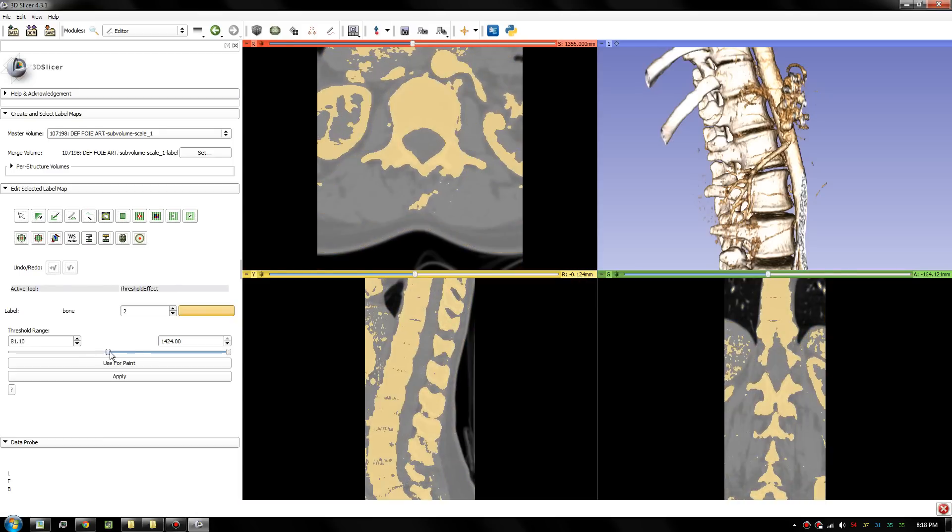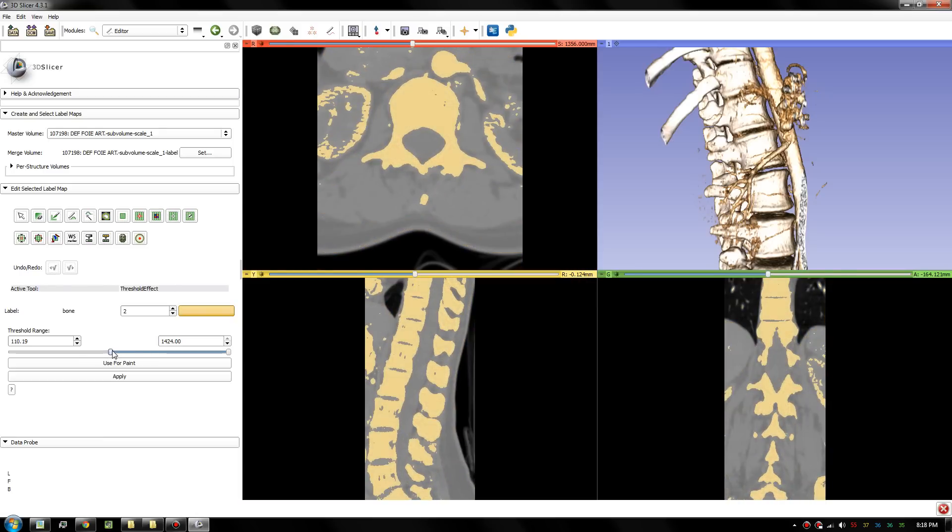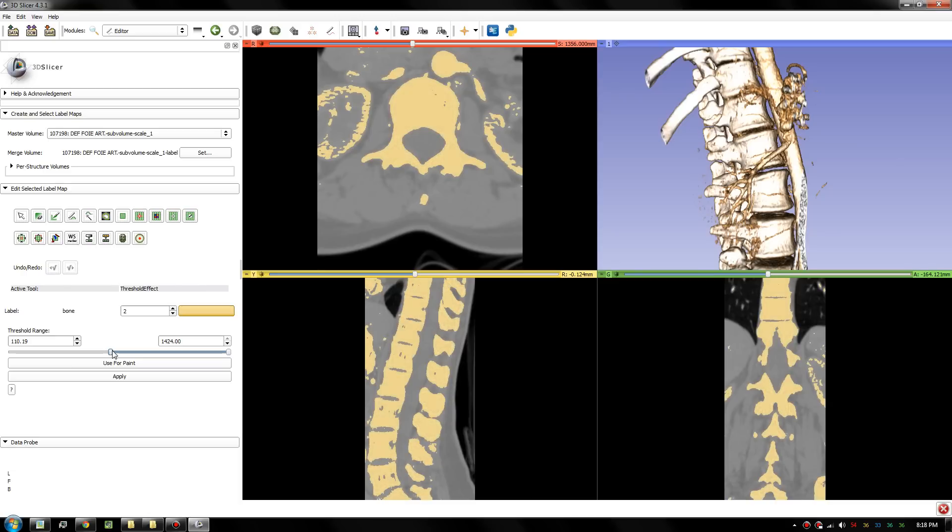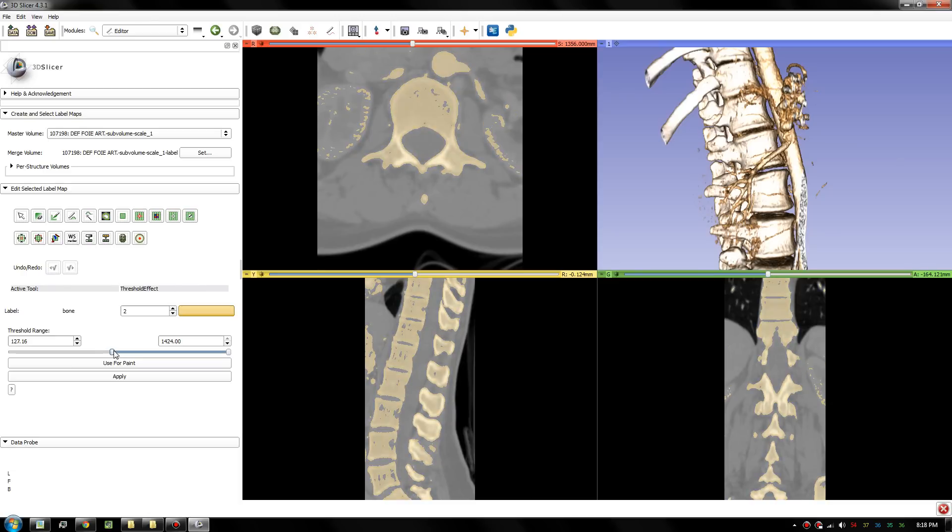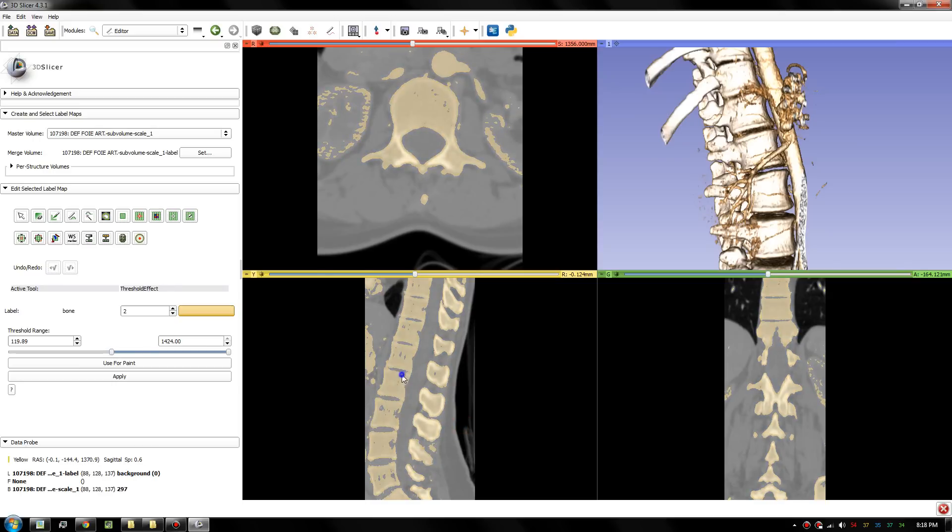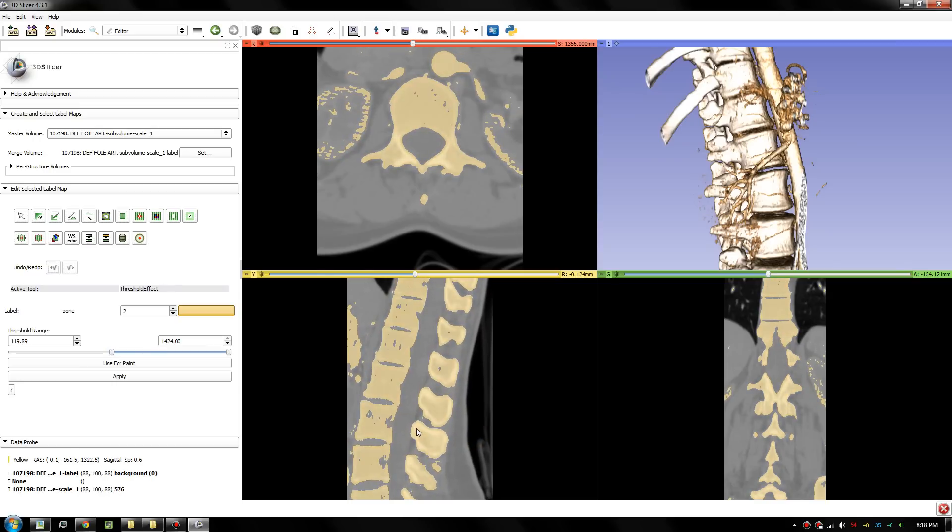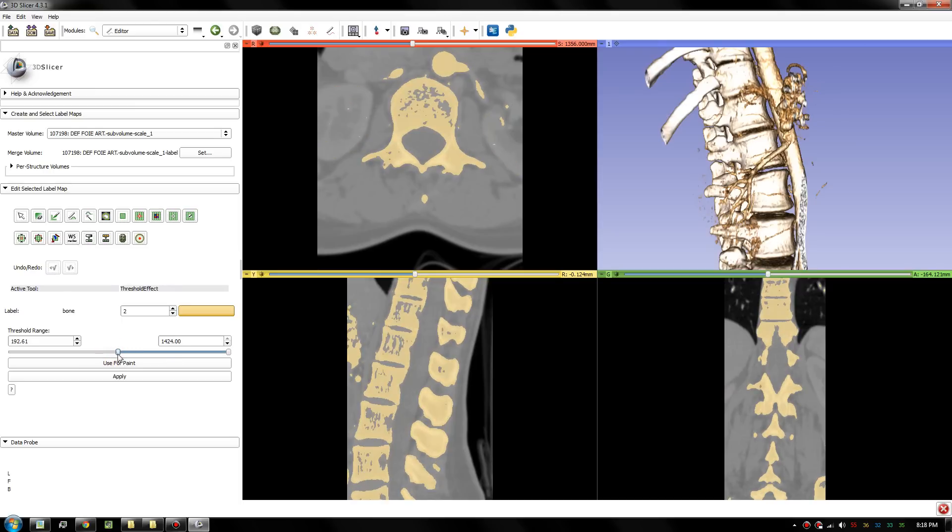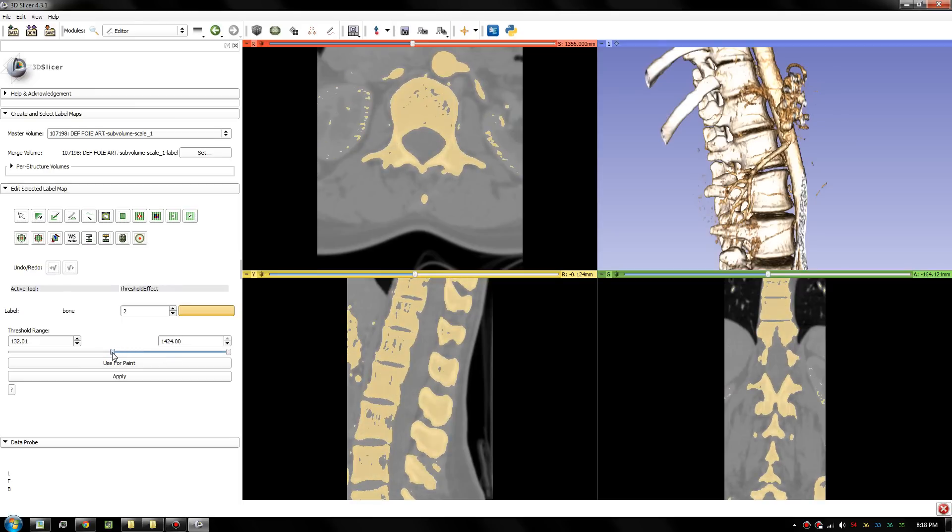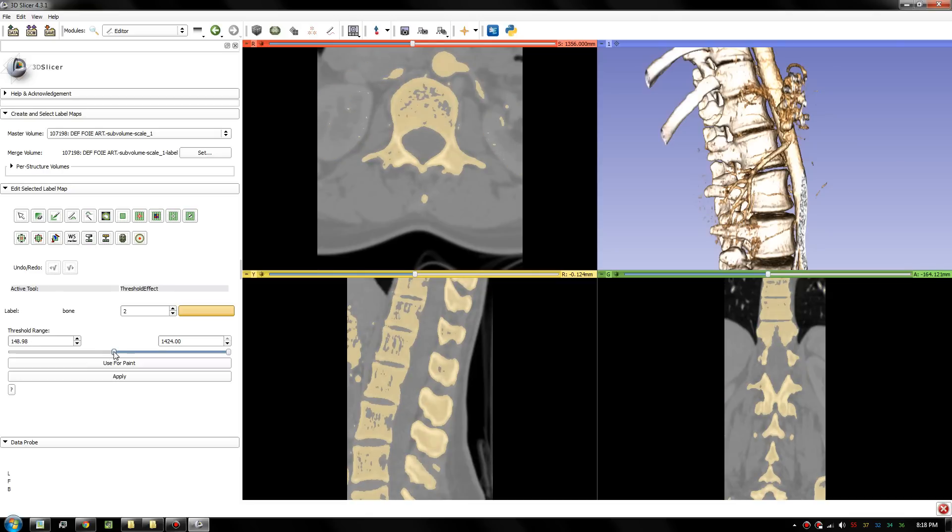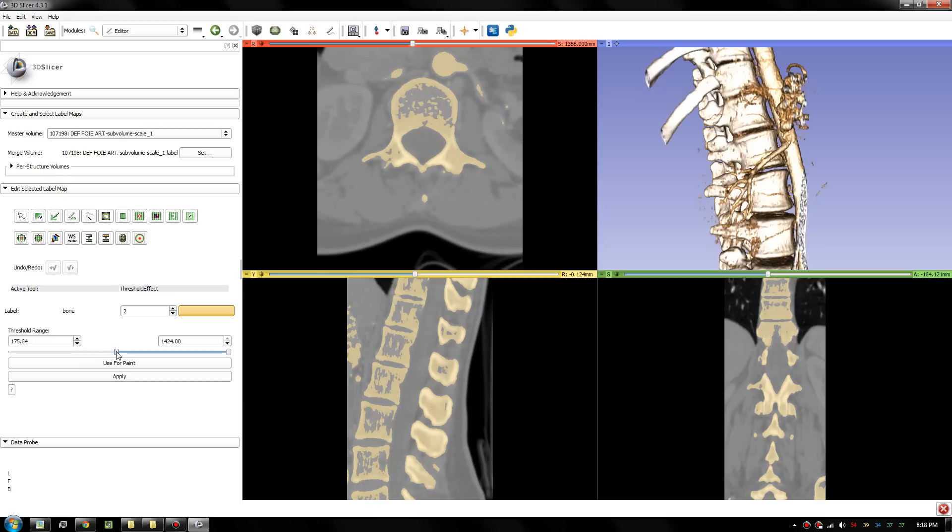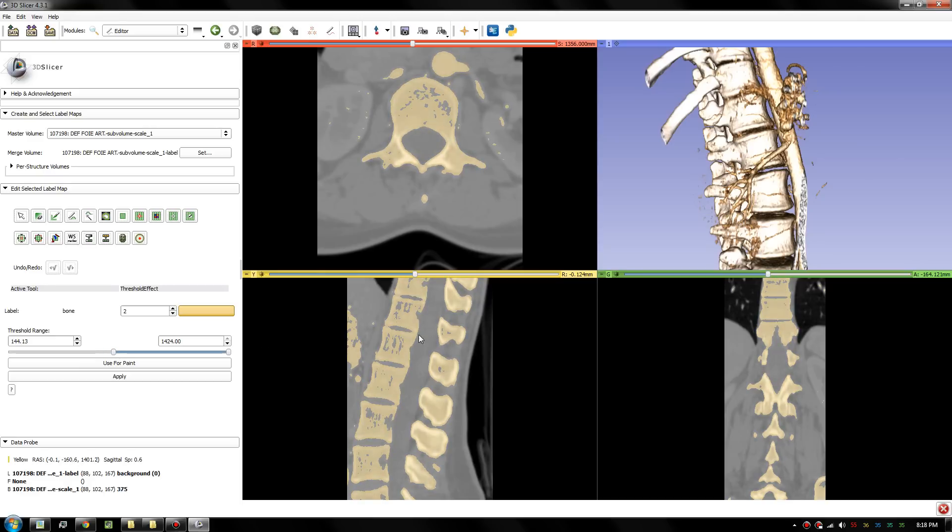That will apply a threshold on the tissue to select only all bones and similar tissue. To zoom in, hold control and left click and drag. Just want to make sure you select the appropriate things for your models. Just be aware this is not for clinical use. It's mainly for visualization.